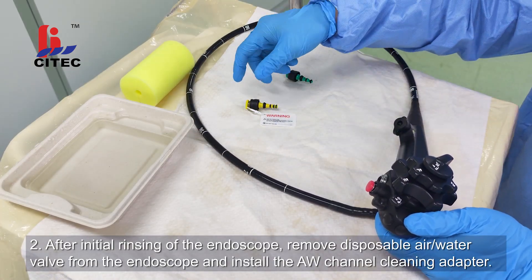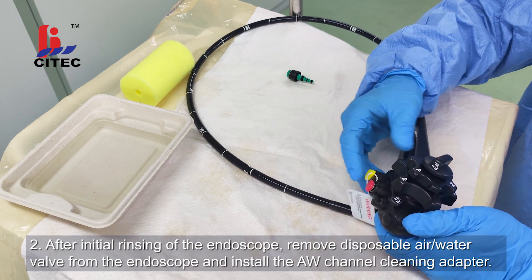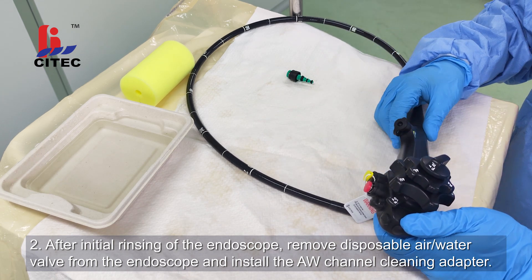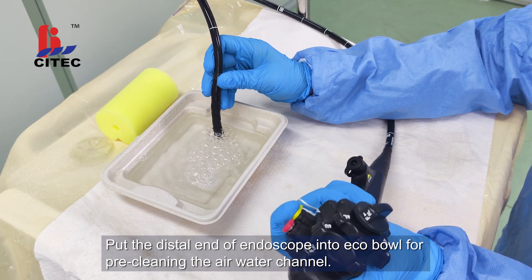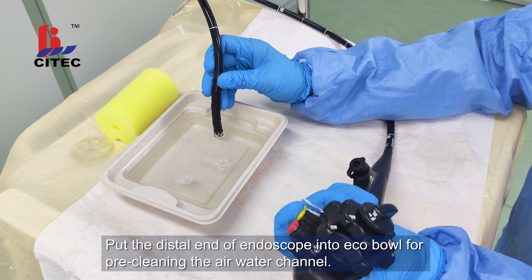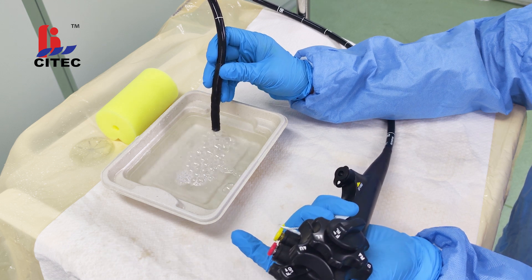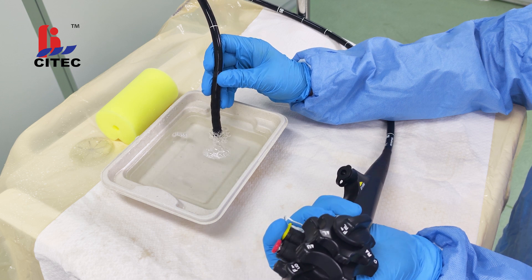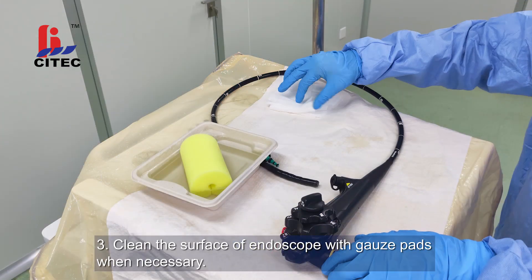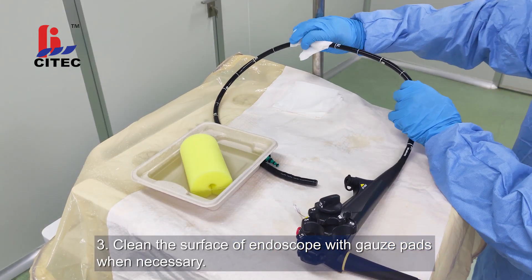After initial rinsing of the endoscope, remove disposable air water valve from the endoscope and install the air water channel cleaning adapter. Put the distal end of the endoscope into eco-bowl for pre-cleaning the air water channel. Clean the surface of endoscope with gauze pads when necessary.